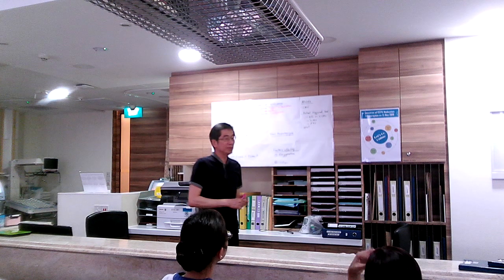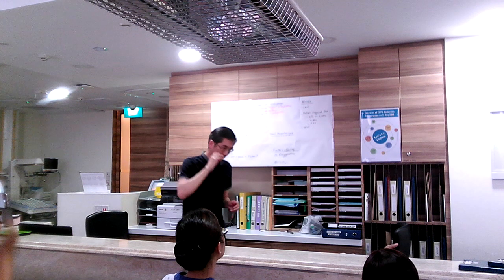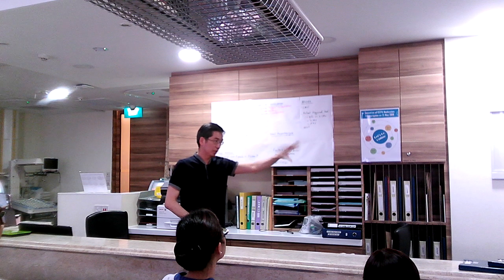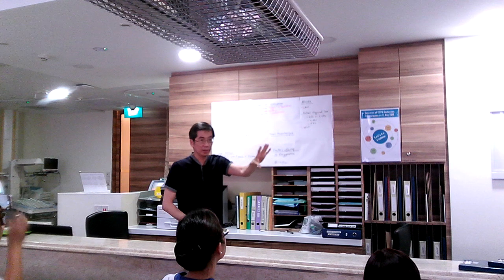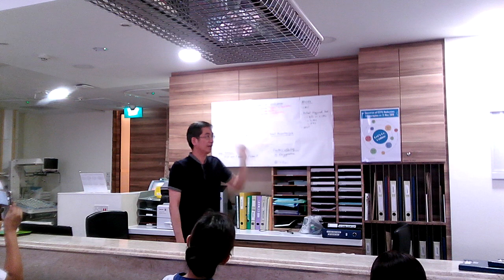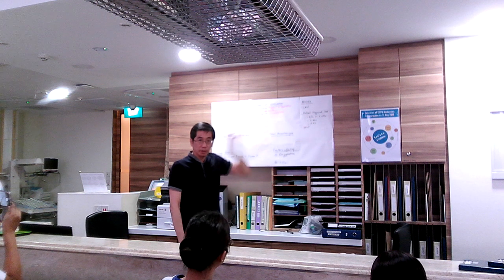Okay, so assist control means it's actually a mandatory breath. That means it's a fixed breath. It pumps in whatever you have set. Let's say you set tidal volume of so much, or pressure of so much, inspiratory time of so much, whatever. It will give a mechanical breath every single time you breathe. So in other words, the moment I take a breath, it will pump the fixed breath.